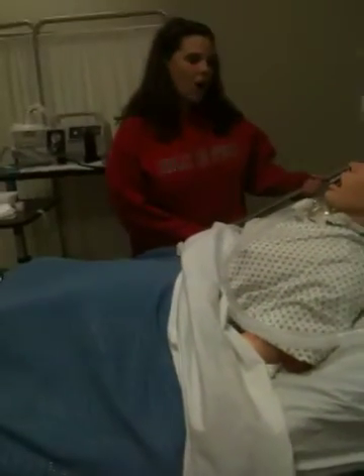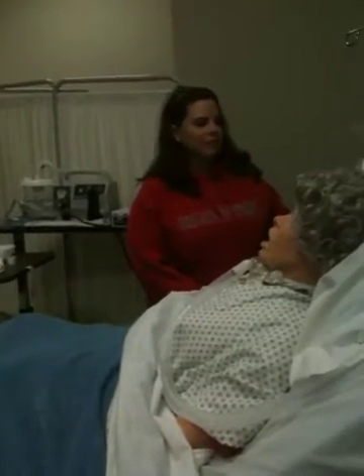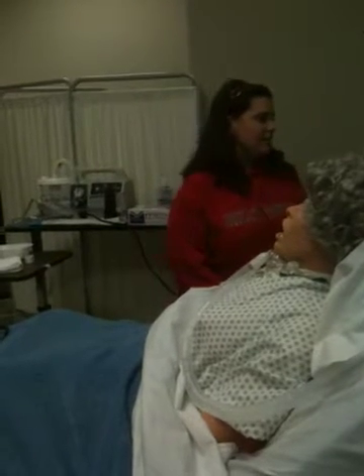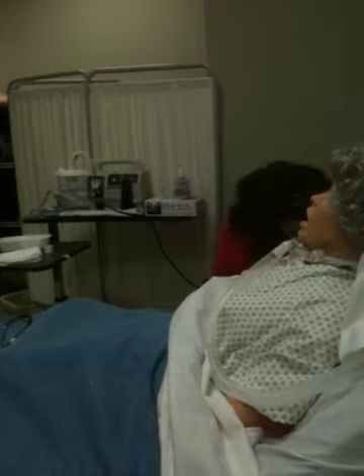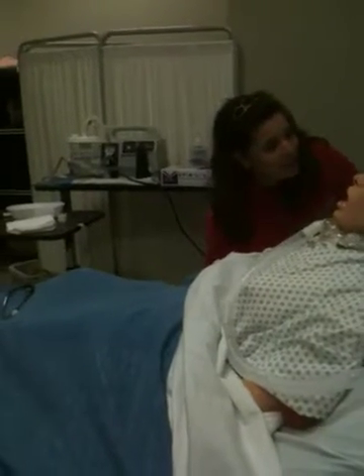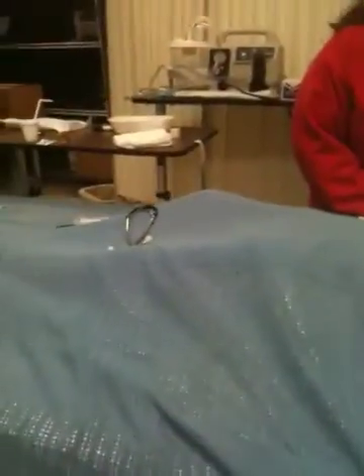I want my patient in a high Fowler's position and I'm going to raise them up as long as they can tolerate it. If it were contraindicated I would have to leave the patient wherever they needed to be. I'll give the patient a tissue to blow their nose and have the emesis basin close by in case they get sick, because remember we're doing this for gastric decompression — their stomach could be full and they may vomit.